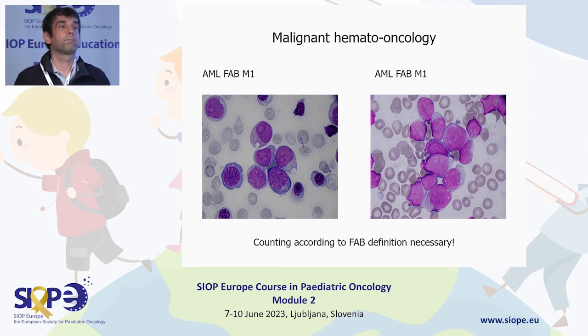Wouldn't the size of the cells guide compared to L2? Very difficult to answer the question. Of course, you are right that the myeloid leukemic cells are usually bigger than the lymphoid cells, but in L2 morphology, you may see patients who really have big blasts, much bigger than what we know from L1 morphology. So at the end, an M0 can never be diagnosed by morphology alone. You definitely need immunophenotyping.